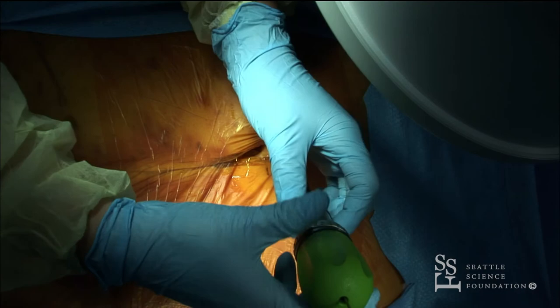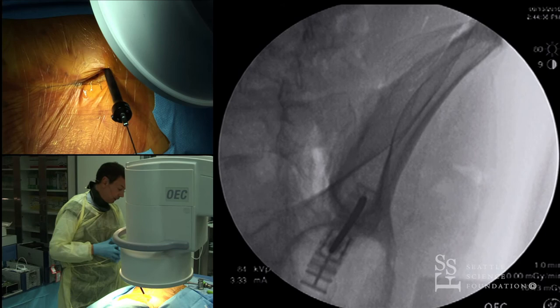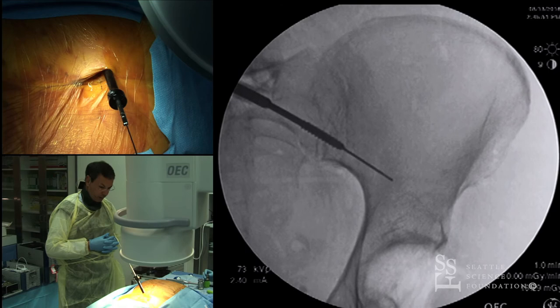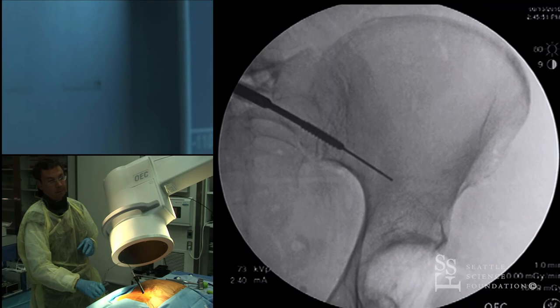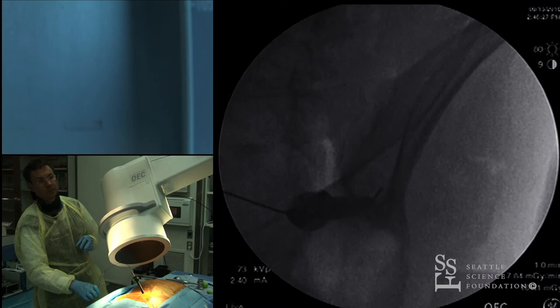Take the handle out for a better view. Take the AP and teardrop images. It looks like we are on track, crossing the SI joint already. In real cases, the guide wire can be a problem, so put a needle holder at the end and bend it so the X-ray tech can maneuver the machine without contaminating the fluoroscopy drapes. The screw looks well contained.